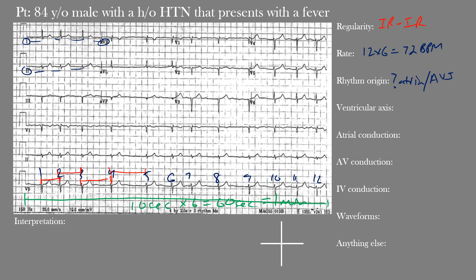For the ventricular or QRS axis, you should have gotten a leftward QRS axis. The actual value here was negative 25 degrees. To find the electrical axis, we look at the QRS complexes. Normal ventricular axis lies between negative 30 degrees and about positive 105 to 110 degrees.